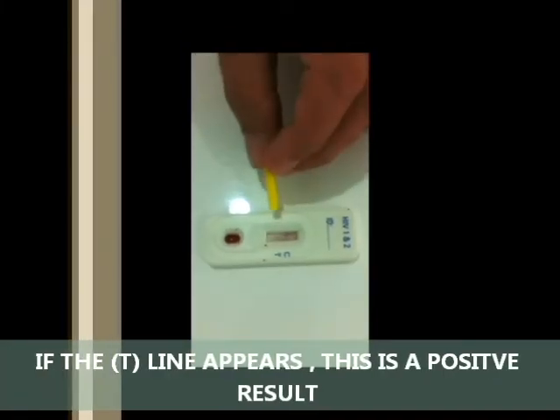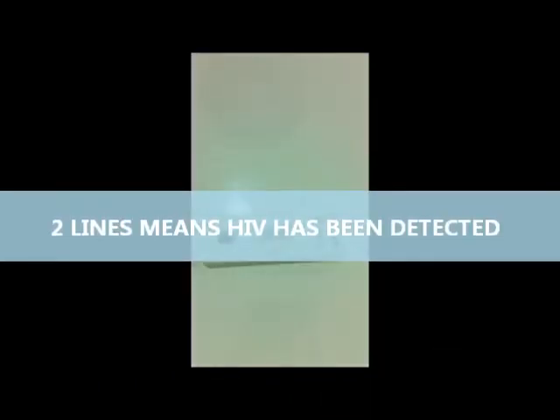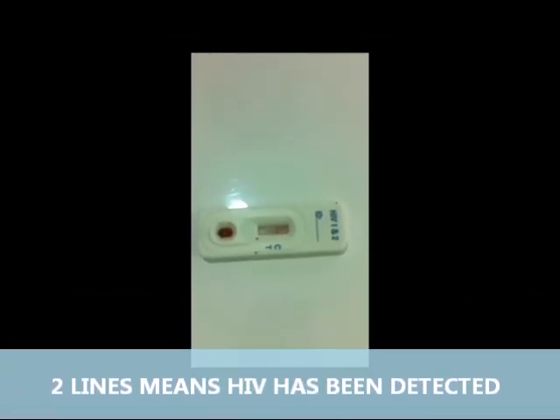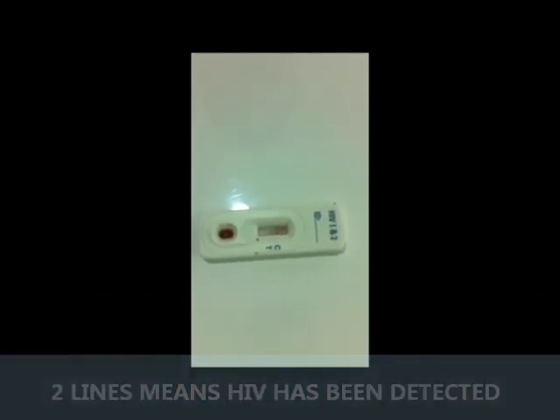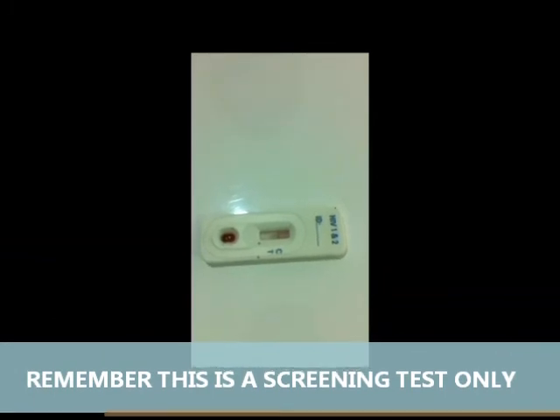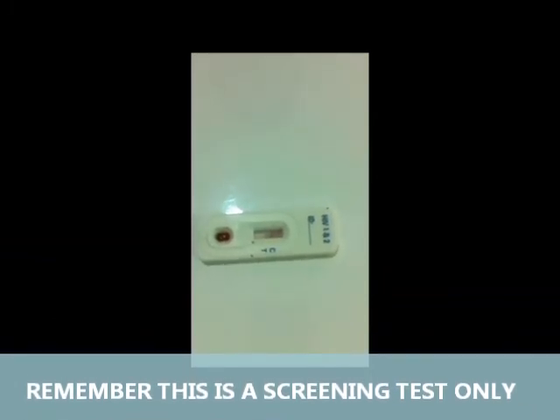The second line that comes up on the T, which is the test line, will show either positive or negative. If there is a second line at the T, the test has detected HIV antibodies, which requires a second test in a laboratory. Remember, this is a screening test only. And there you have it — a SureTest Medical HIV Rapid Test Kit.